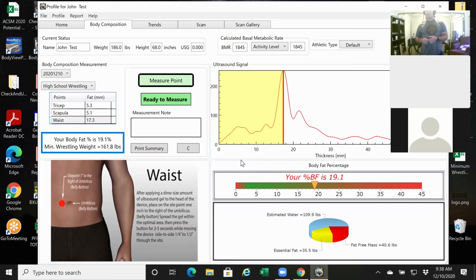You guys, Nick and Courtney, I have no doubt that you are phenomenal with your athletes and your kids. It's not going to be a big deal to ask for their help. Have them pull it up so you can get to the site and then take a measurement. Now, this assessor said the reading on this particular kid was at 43 millimeters. So again, if we think about our depth scale here, that made sense based on his description to me, not even seeing this gentleman. But the assessor wasn't 100% confident, and I understand.